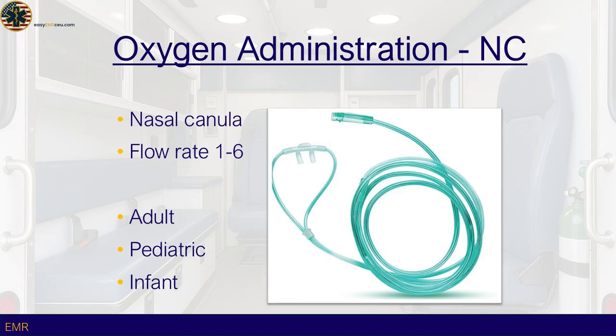They are ineffective for patients in severe respiratory distress or those requiring high-flow oxygen, such as in cases of major trauma, shock, or respiratory failure. Furthermore, dry oxygen flow can cause nasal irritation over time, which is why humidified oxygen is preferred for prolonged use, though this is not always available in the pre-hospital setting.